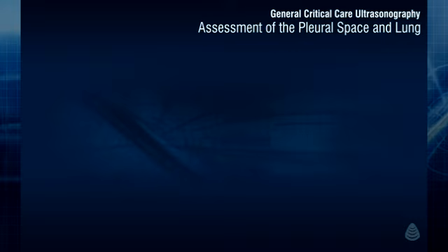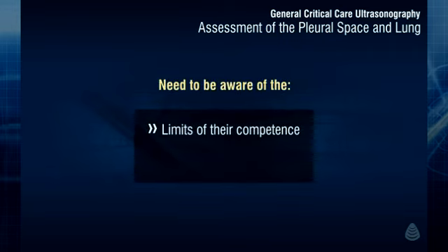In order to avoid overdiagnosis or underdiagnosis of disease or conditions, the bedside sonographer needs to be aware of the limits of their competence and of the limits of the modality.